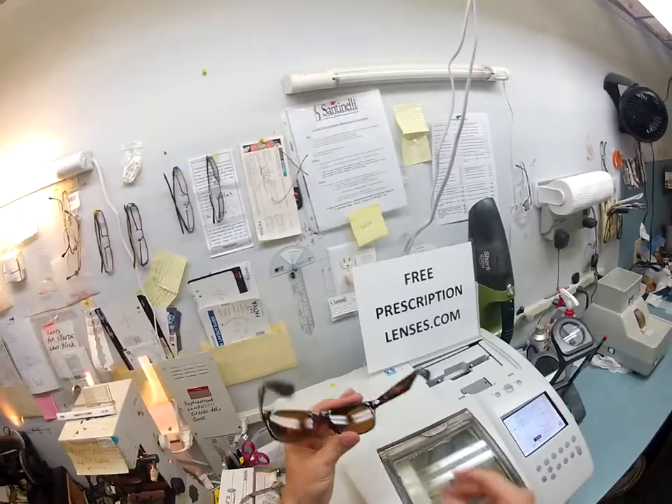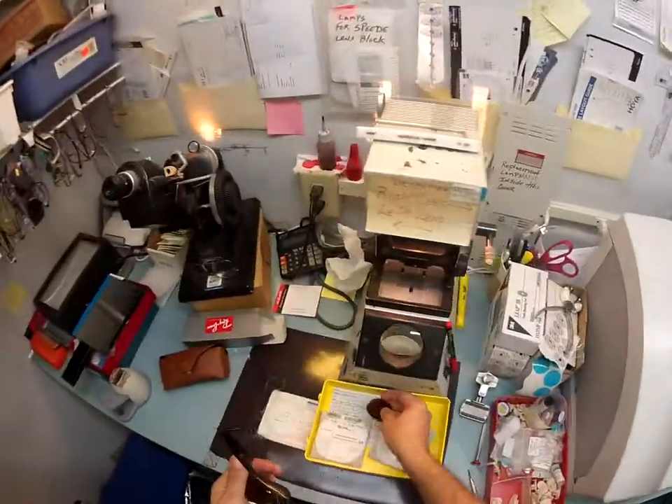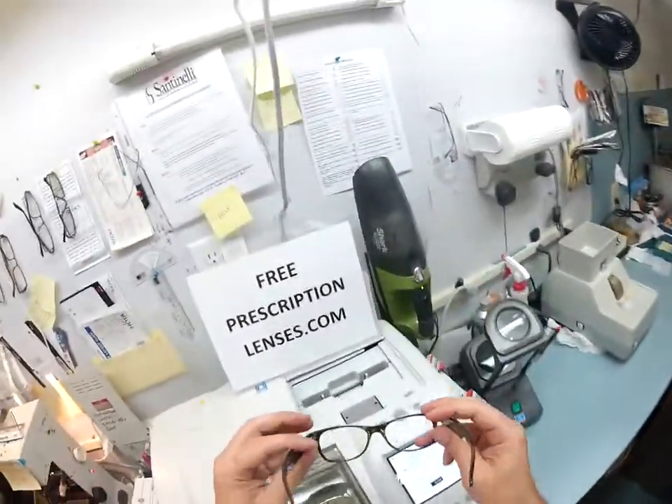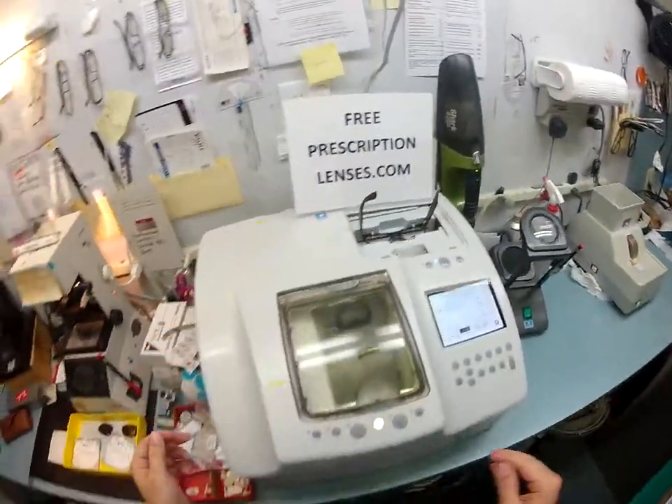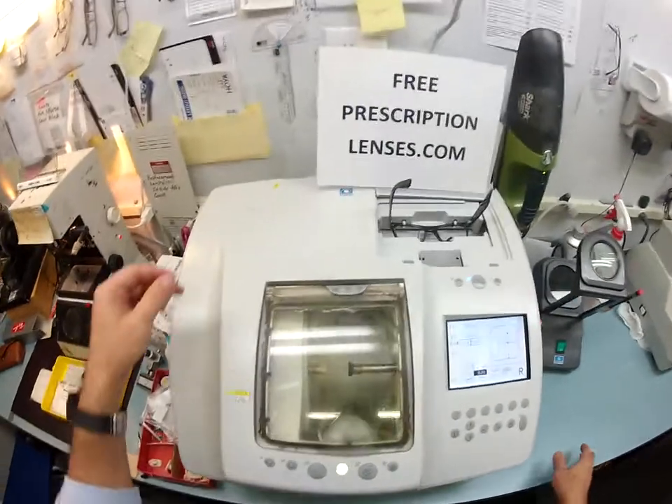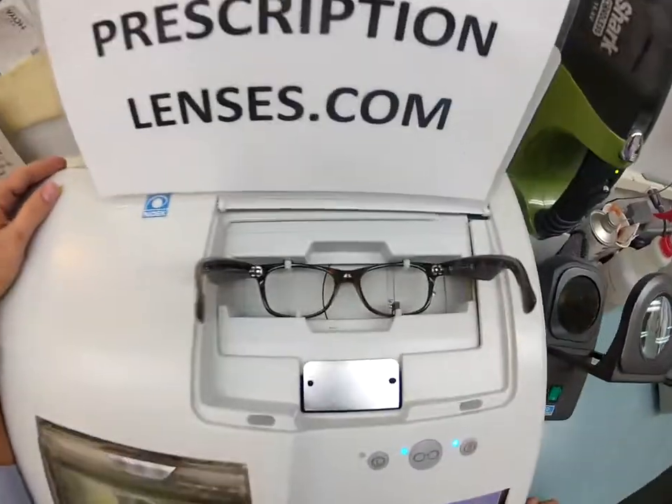The first thing I'm gonna do is pop out the original lenses — I'm gonna hang on to these because I'll show you what I'm gonna do with them later. I'm gonna put your Italian frame into my Italian edger; this is a Santinelli LE 1000 patternless edger.